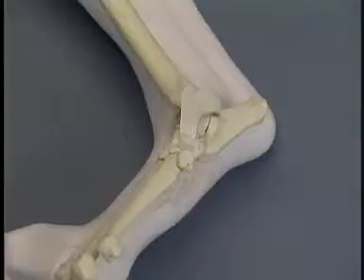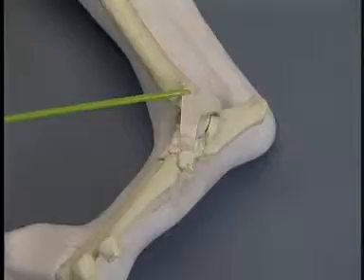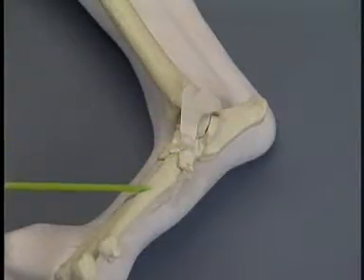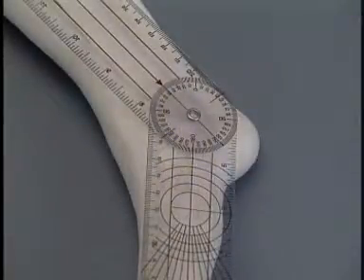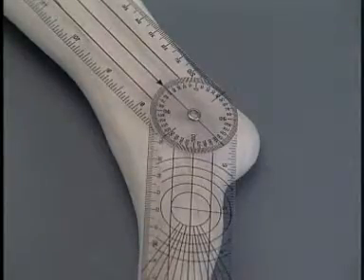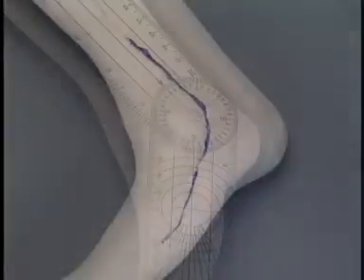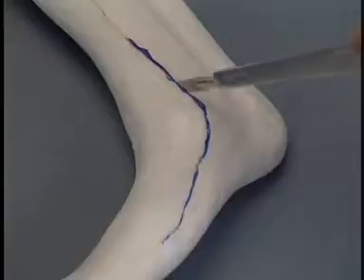The landmarks for the incision are the distal diaphysis of the tibia, the medial malleolus, and the metatarsal bones. The angle for the pantarsal arthrodesis is predetermined by observing the normal standing angle of the tarsus in the individual patient. The angle is usually between 135 and 145 degrees.